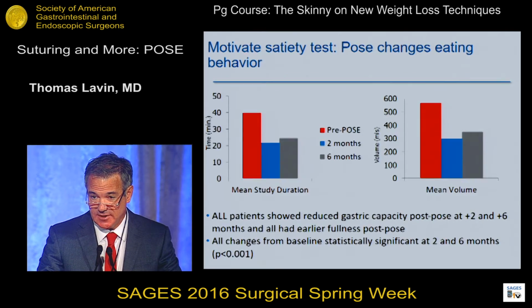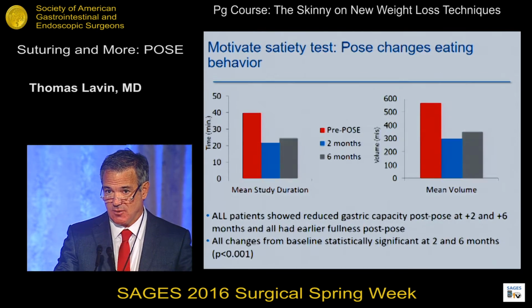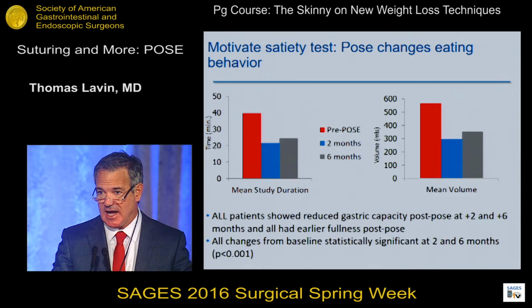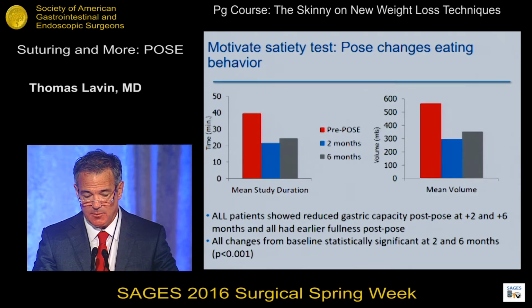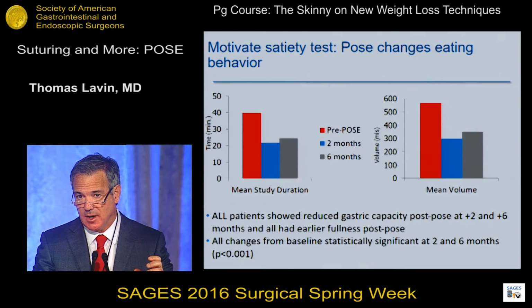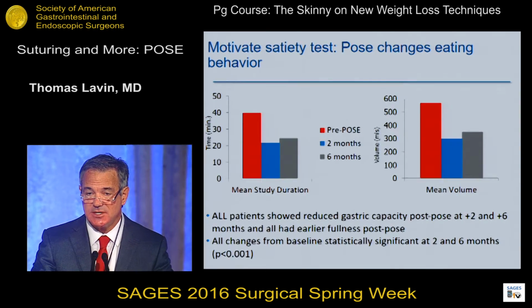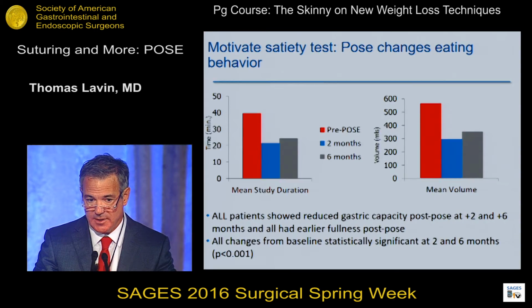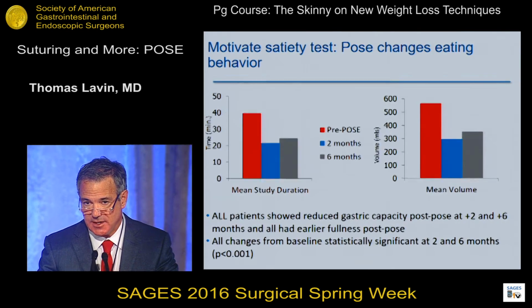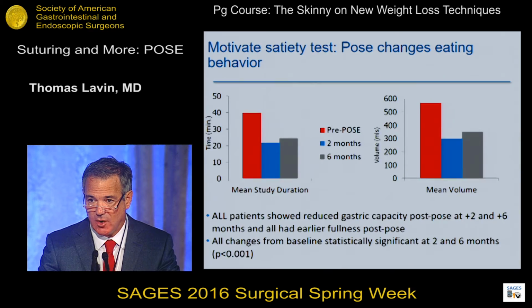This is very significant, and we've seen this across the board since we've been involved with the POSE procedure. Patients describe this satiety change. And so to study it, the MOTIVATE group had patients drink liquid meals over about every 3 minutes, and they had the patients tell them when they felt full and couldn't drink anymore. There was a statistically significant change between pre-POSE and then at 2 months and 6 months in both time and volume, as you can see here. And that was consistent with what we had felt early on in the POSE experience.